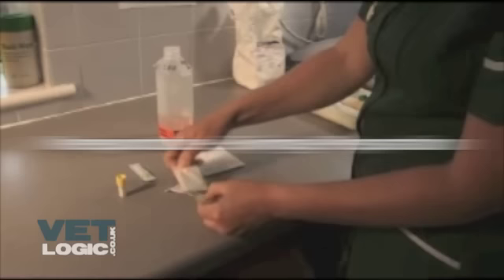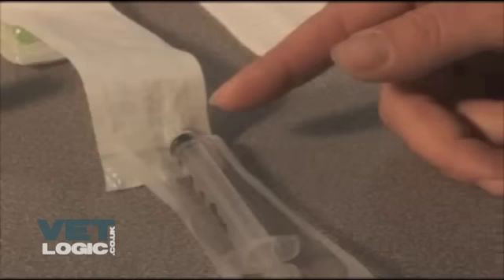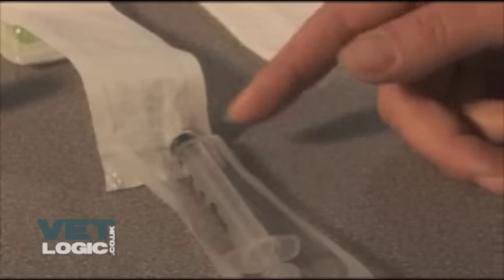Syringe preparation. Removing the sterile packaging from the syringe, making note of the lower end of the syringe where the needle attaches and not to touch this area, as you may need to keep this sterile.